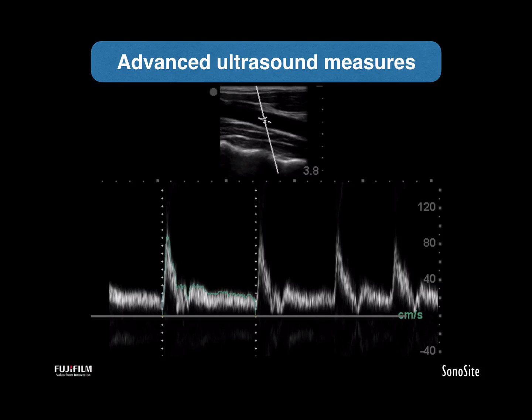Think of it as doing a femoral line or an IJ, but instead you're looking at the carotid or the femoral artery, and you can see how much easier it is than actually getting an apical 5 chamber. However, there's one major limitation to arterial Doppler, and this has to do with the accuracy of velocity measurement and its relationship to the difference between the inclination angle, or the direction of the sound beam, and the direction of the actual blood flow.